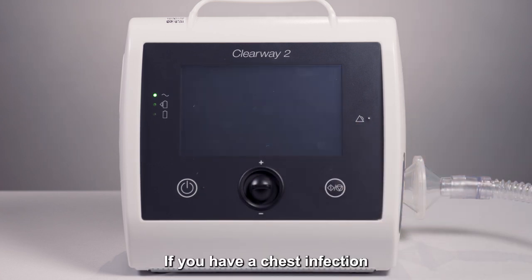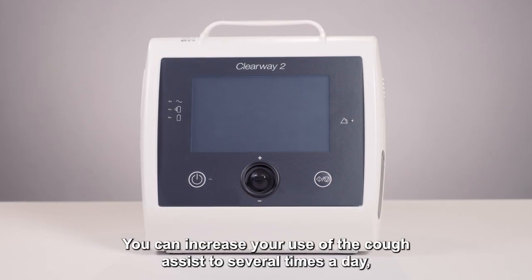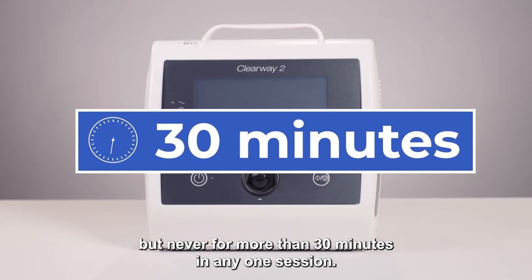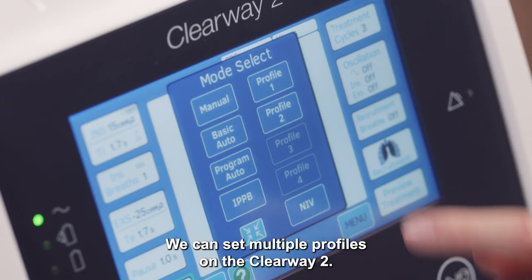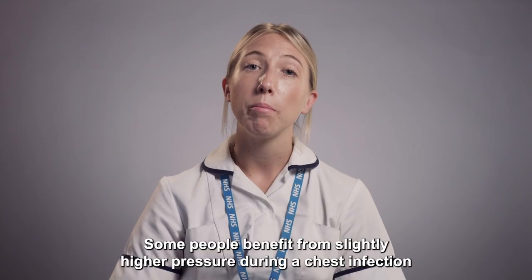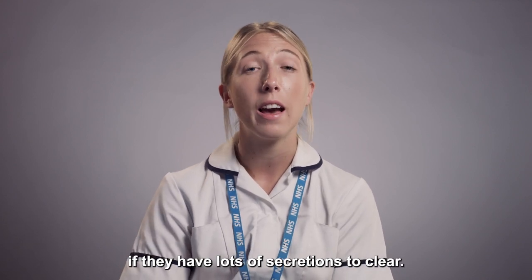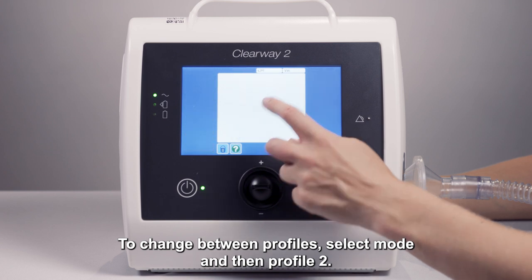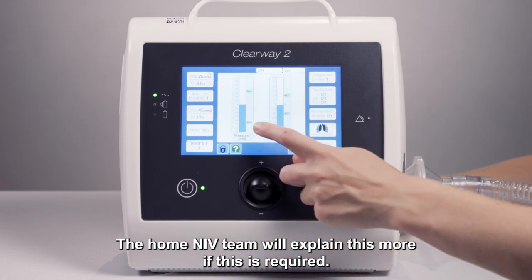If you have a chest infection, it's important you keep using the Cough Assist. You can increase your use of the Cough Assist several times a day, but never for more than 30 minutes in any one session. We can set multiple profiles on the Clearway 2. Some people benefit from slightly higher pressures during a chest infection if they have lots of secretions to clear. To change between profiles, select Mode and then Profile 2. The Home and IV Team will explain this more if required.